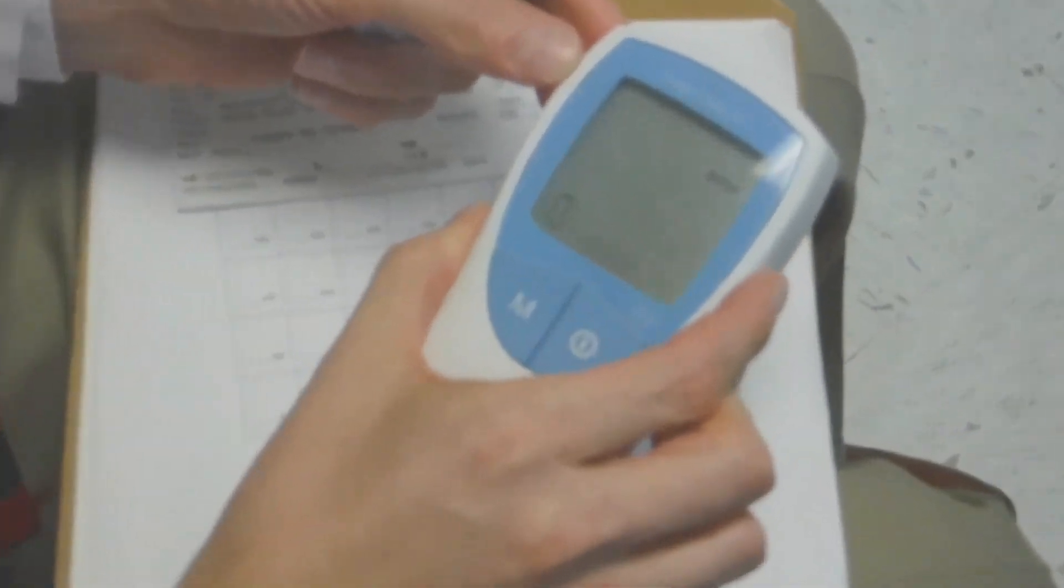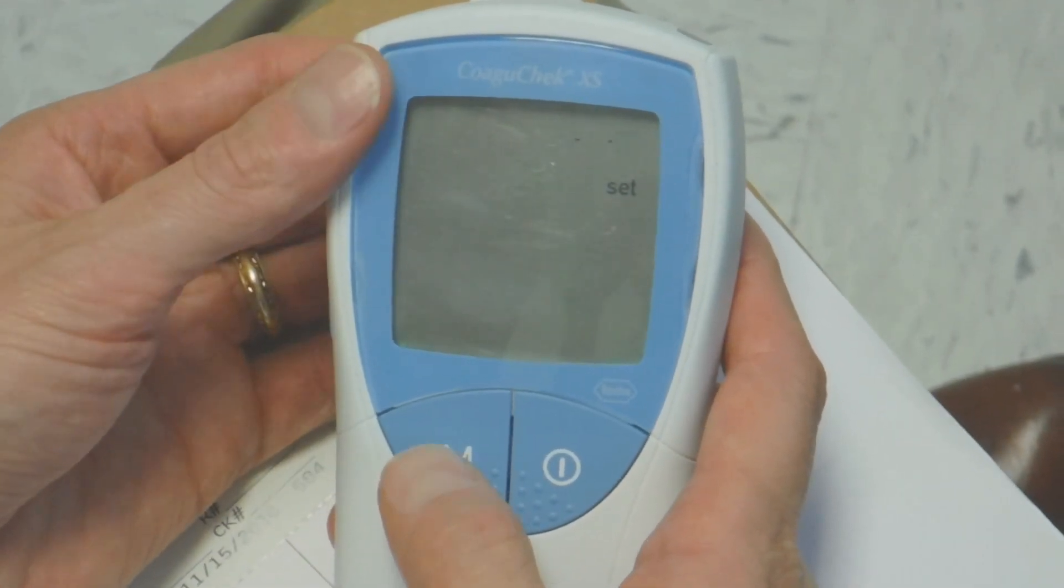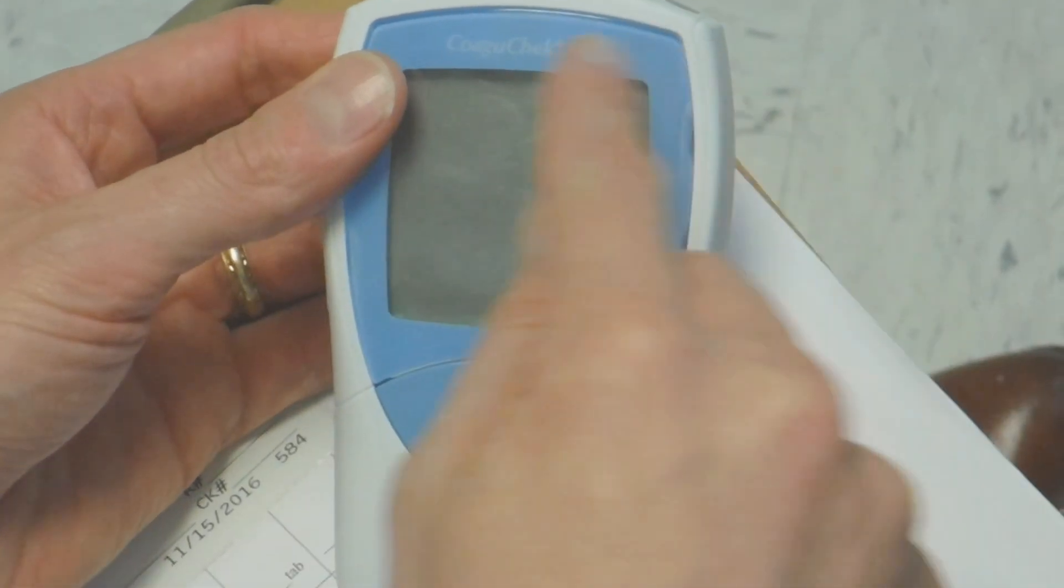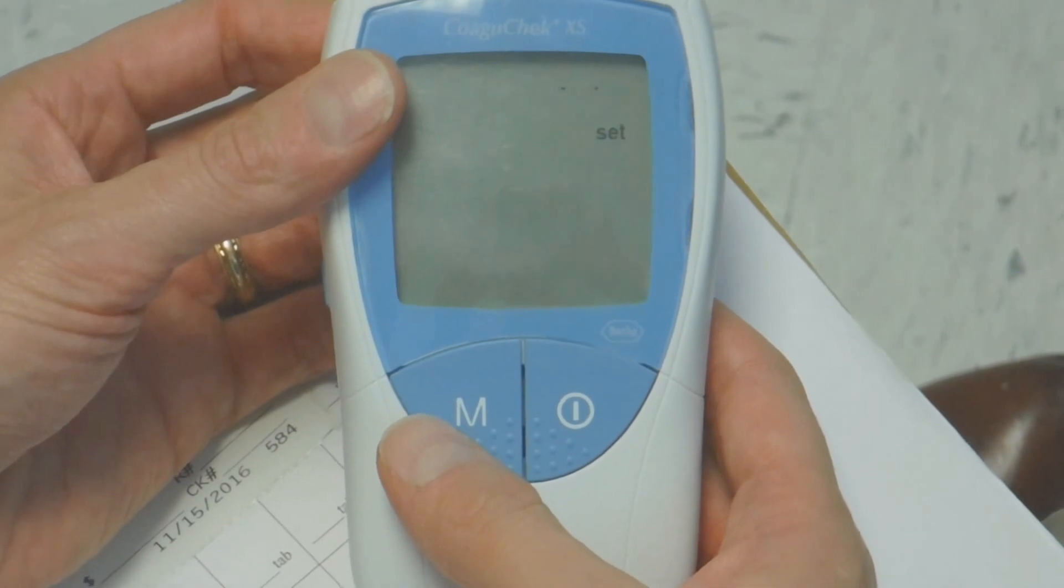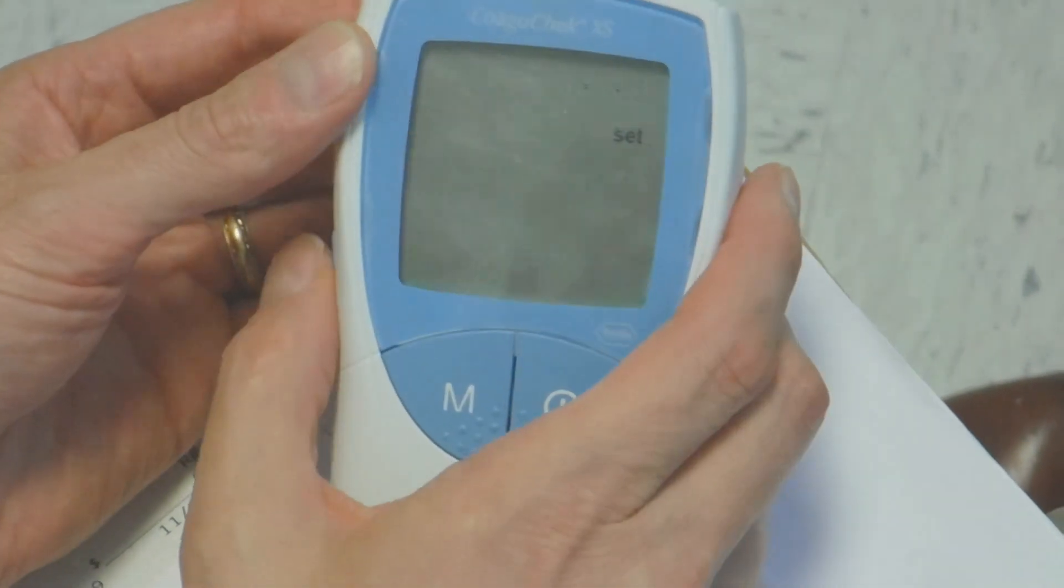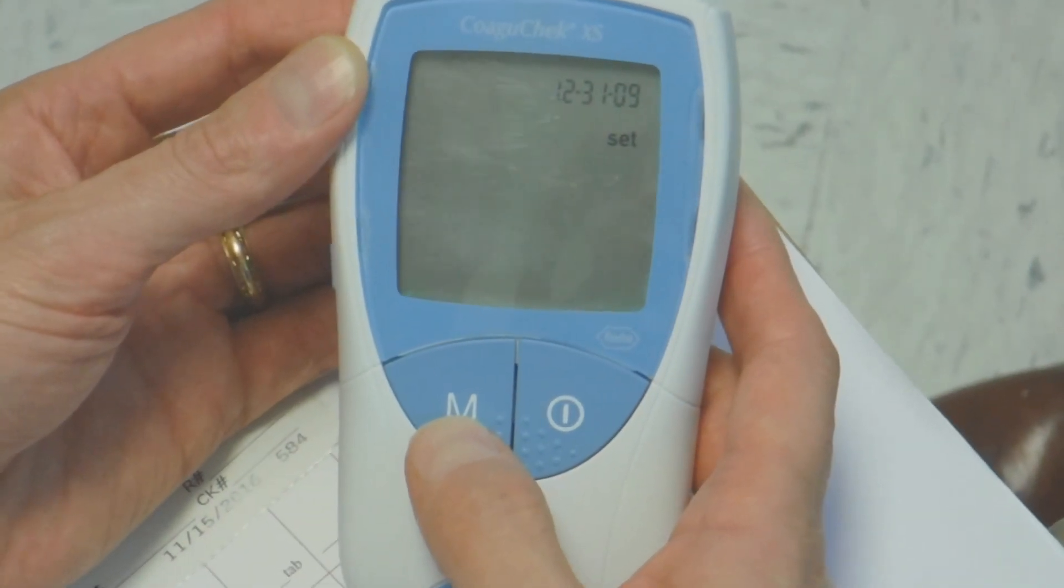Do we need to put the date and time in there? Alright, so this is giving you the option as far as date, month, year, or month, date, year. Yeah, month, date, year. Works for me.